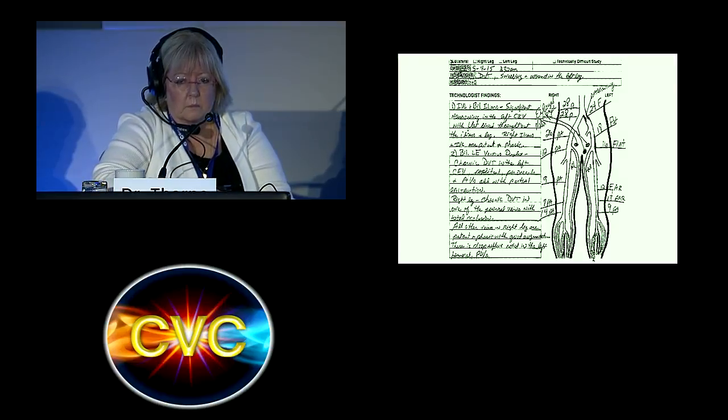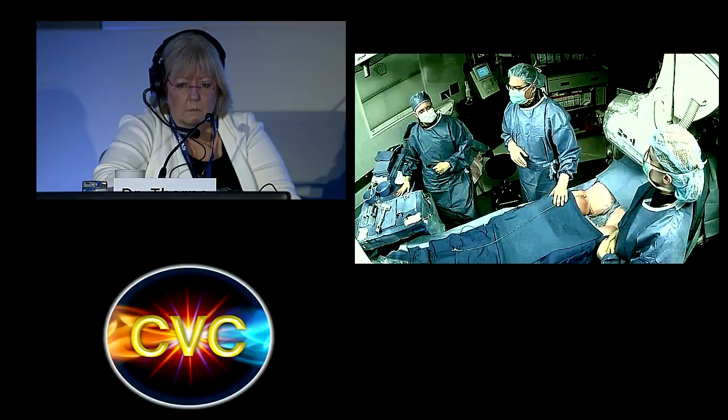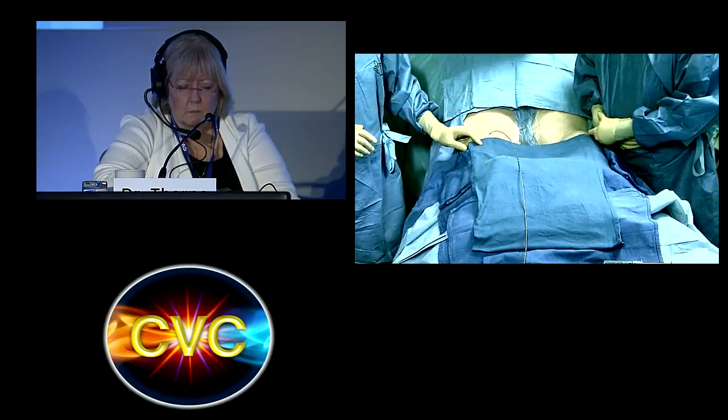There's some reflux in the deep system now. Perhaps there's some damage to the valvular apparatus of this system. But if we move forward with this case, let me show you what we decided to do. I know that he has some changes in the common femoral, so I put this gentleman of 300 pounds on his belly. So we have a prone position, and we decided, if you look here, to do a popliteal approach. We use the ultrasound to guide our needle. It was a very straight and clean puncture of the popliteal vein. And I put a 9 French sheath over a .035 glide wire.